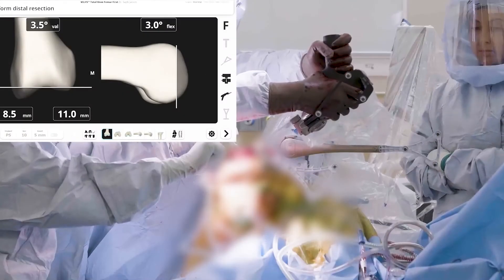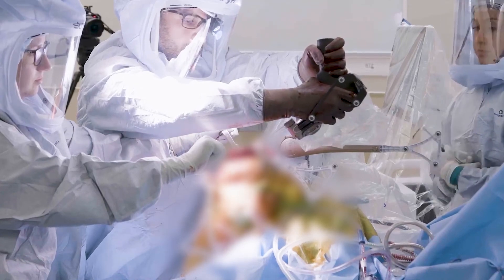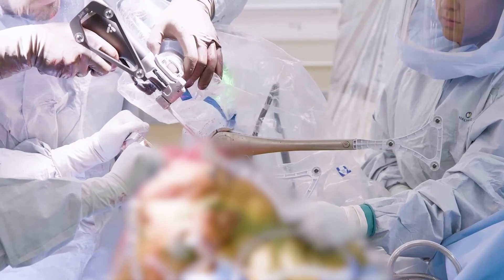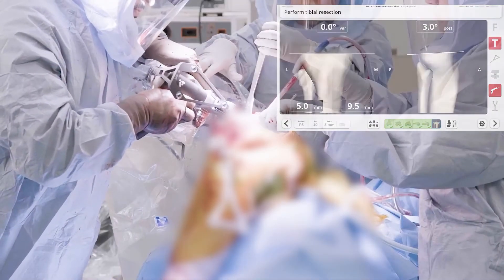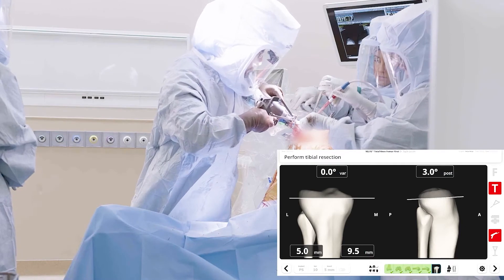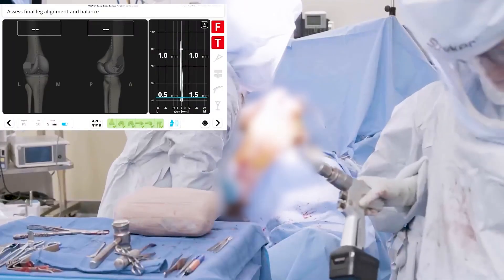Once the bone resection plan is completed, your surgeon will utilize the robotic system to complete the bony cuts with an accuracy of 1/32nd of an inch. Therefore your surgeon will be able to precisely position the final implants. It is important to note that your surgeon is in complete control of the robotic system from start to finish.